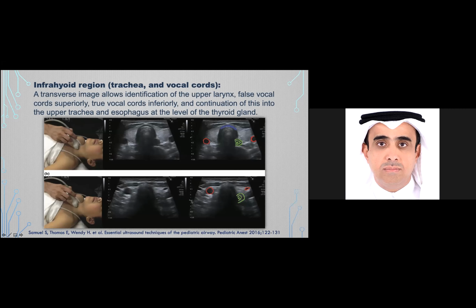We can, for example, see if they move symmetrically. They become even more apparent when the model phonates.